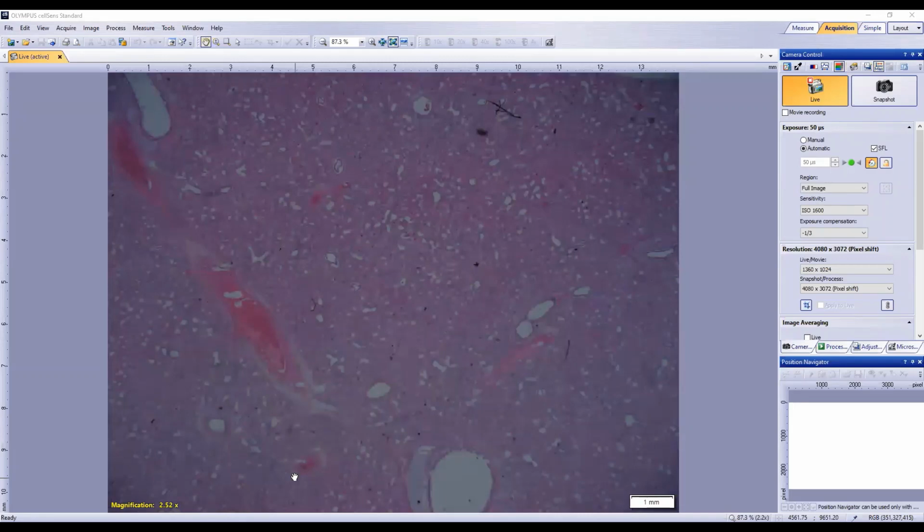Viviana, can you unmute yourself and talk us through hyaline membranes? That's a really, really important thing when we're looking at a lung like this. Was just thinking of, when there is complete disruption of the air-blood barrier, and we get leakage of plasma proteins, and they mix with the cellular debris that is within the alveolar spaces, and that just forms the membranes covering what's, I guess, been disrupted. Yes, that's a perfect pathophysiologic description.